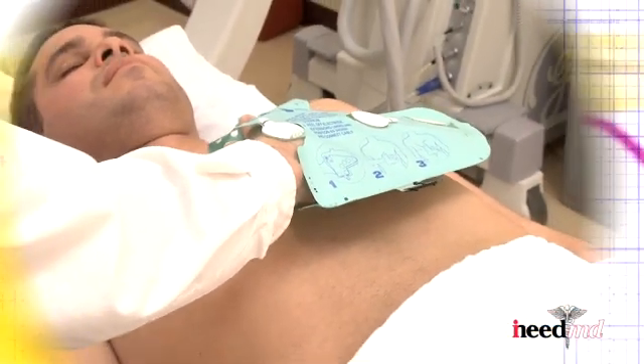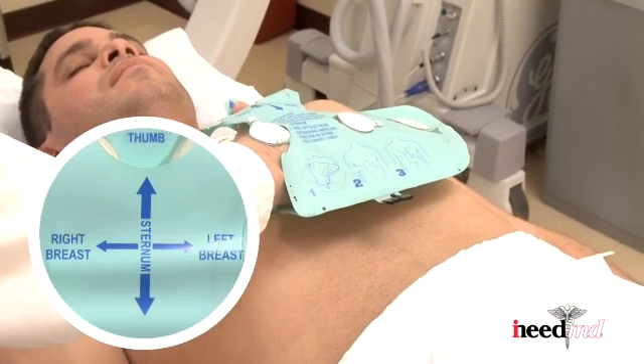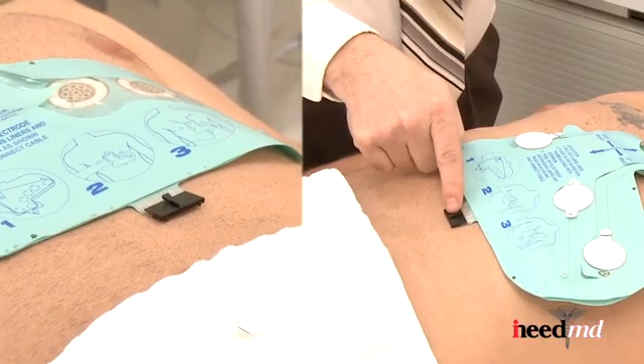Next, align the glove to the center of the chest so the thumb aligns over the sternum and between the right and left breast. Refer to the arrows on the glove for location. The black connector should be pointing directly down.